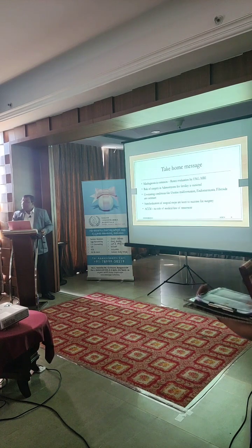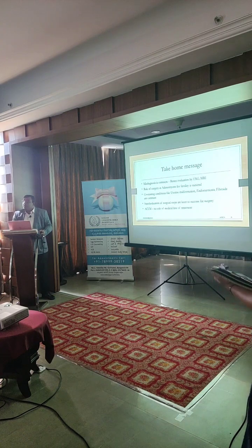I thought it's just 15 minutes, so I didn't put another video where I was called for a surgery where she had multiple myomas. Uterus was around 18 weeks size. We started removing the myomas one after the other. Then I saw a lesion in the fundal area. As soon as I gave vasopressin infiltration, I said, this is not a fibroid, this is an adenomyoma.